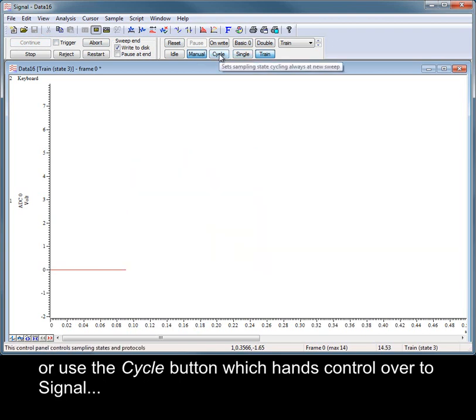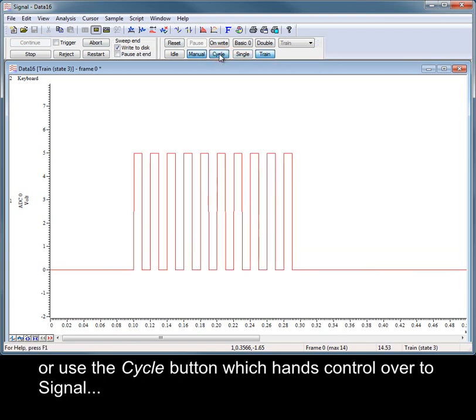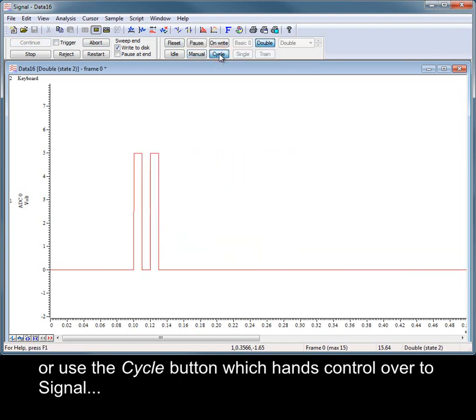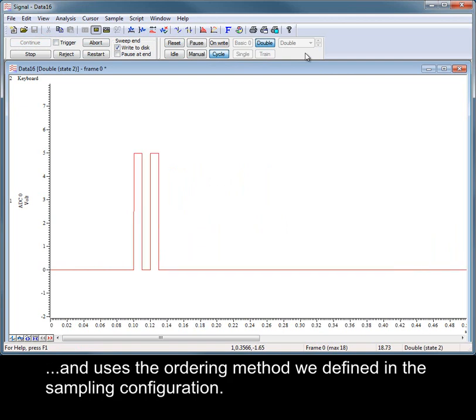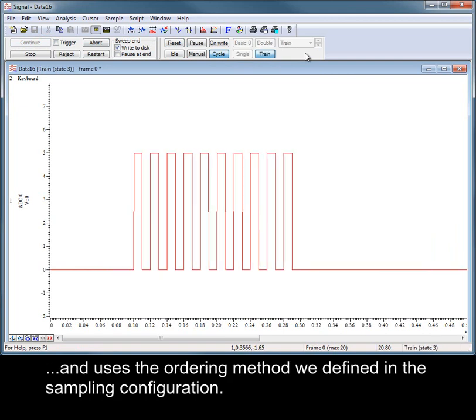Or use the cycle button which hands control over to Signal and uses the ordering method we defined in the sampling configuration.